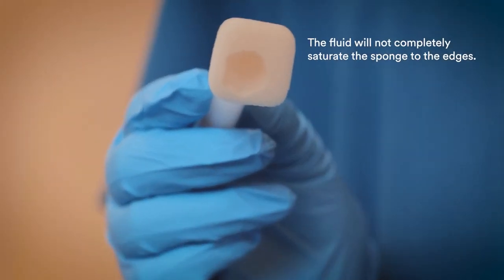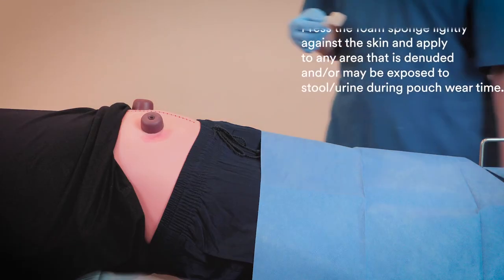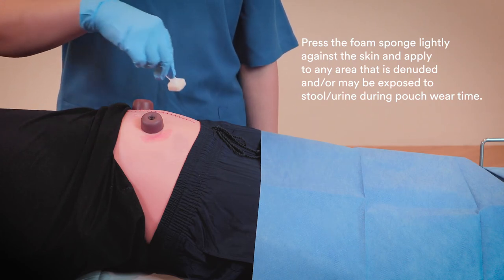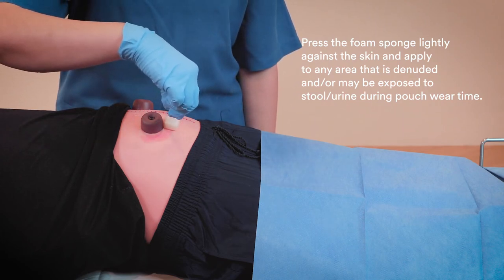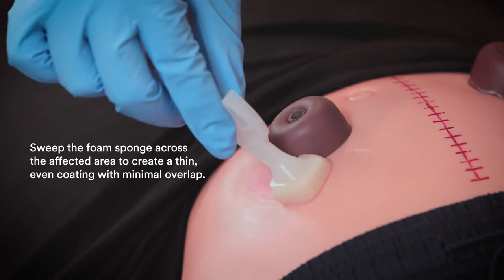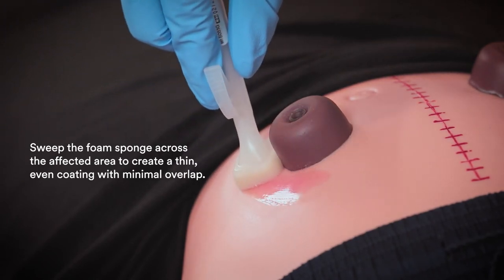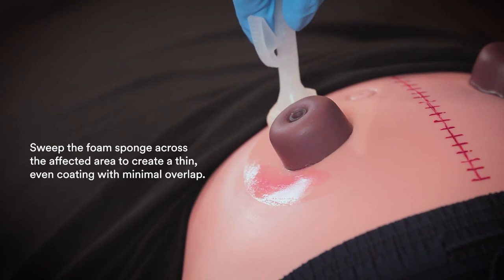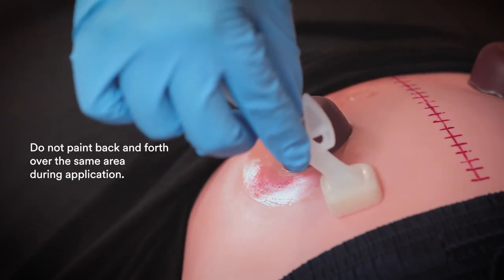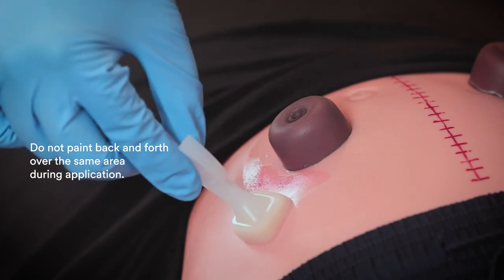The fluid will not completely saturate the sponge. Press the foam sponge lightly against the skin and apply to any area that is denuded or may be exposed to stool or urine during pouch wear time. Sweep the foam sponge across the affected area to create a thin, even coating with minimal overlap.